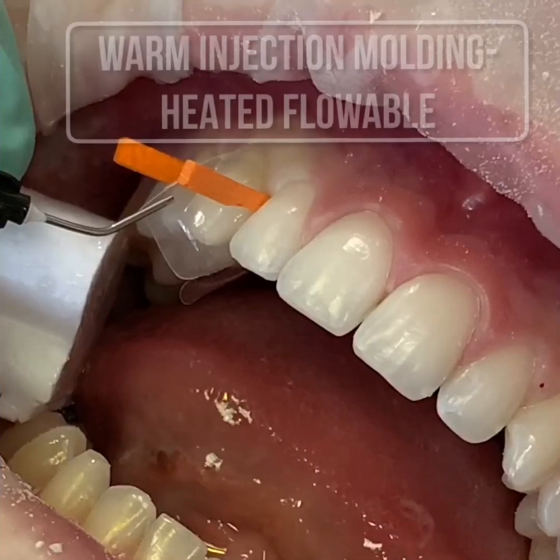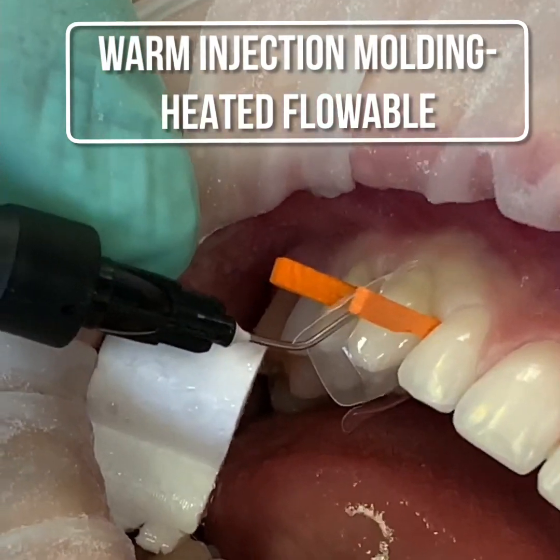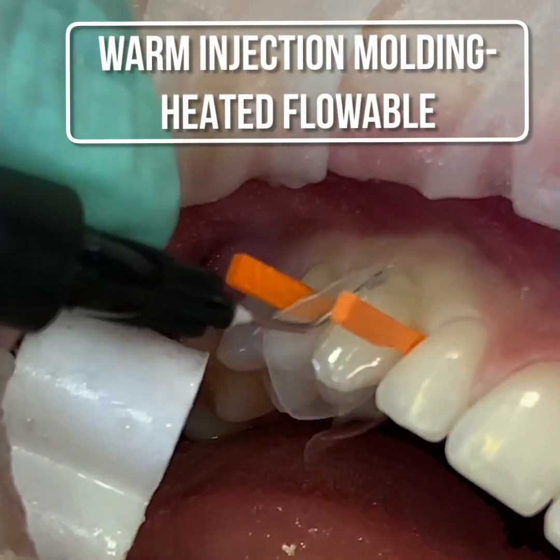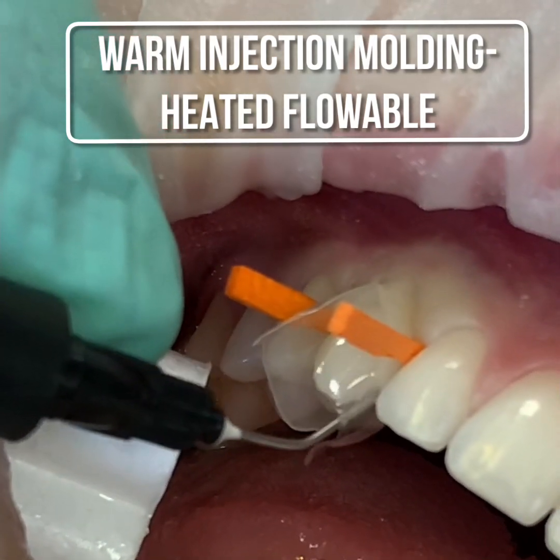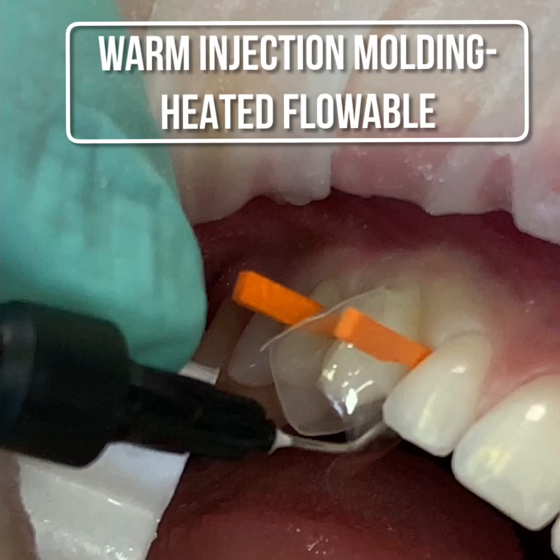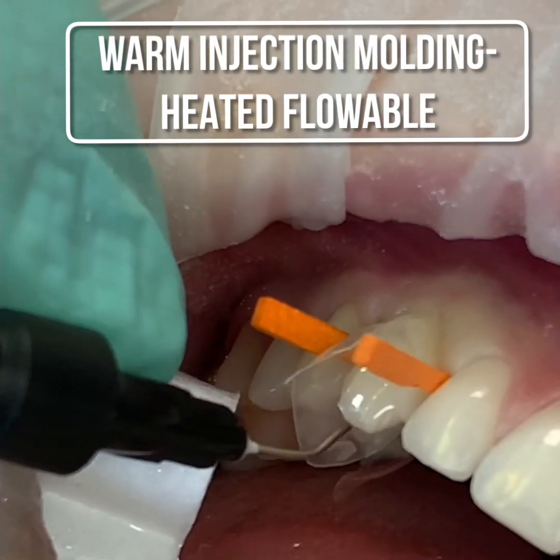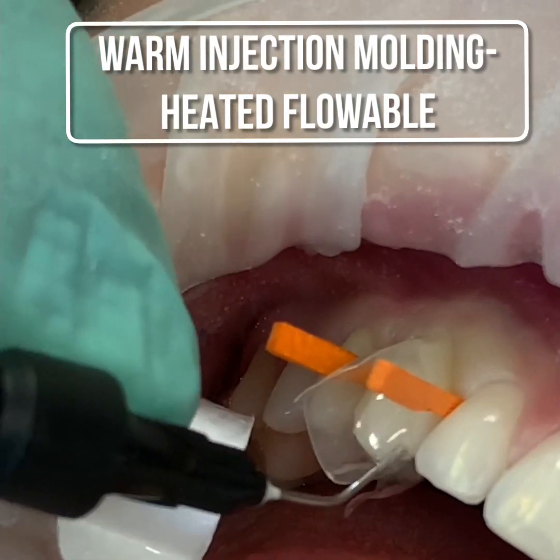Next, we go through the warm injection molding process. First, we use a warmed flowable composite to secure the margins around the tooth so that we get a great seal. This ensures that we will have great adaptation to the tooth and there won't be any staining around the edges.